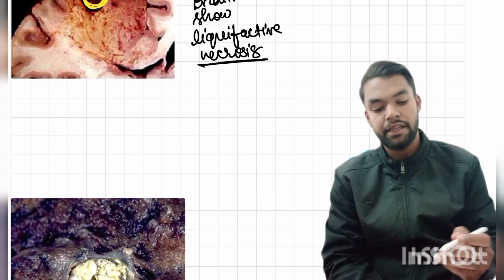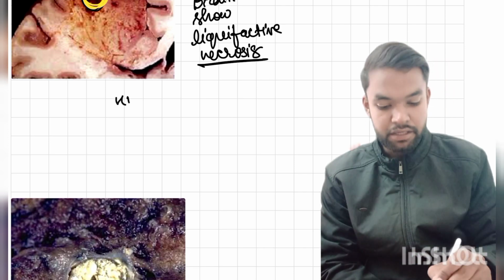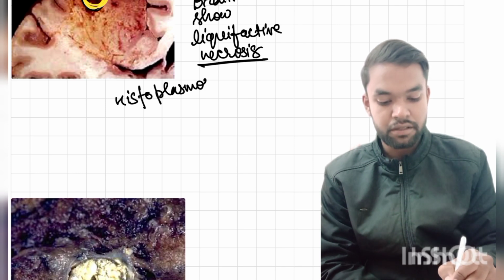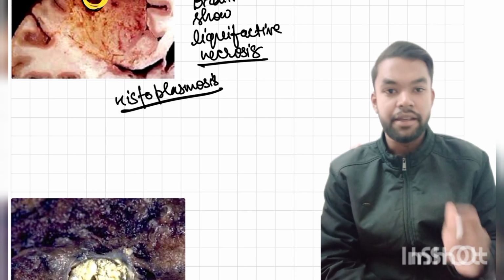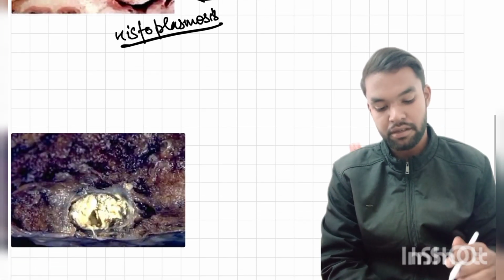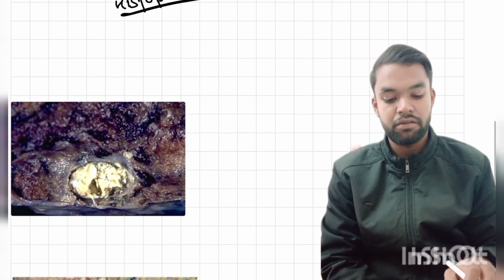Apart from the brain, a fungal infection like histoplasmosis also shows the liquefactive type of necrosis. Next diagram is shown on the screen.